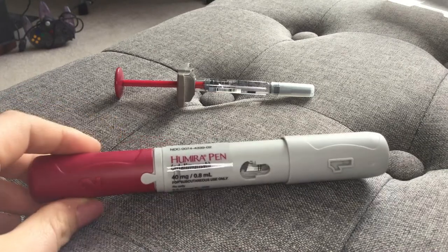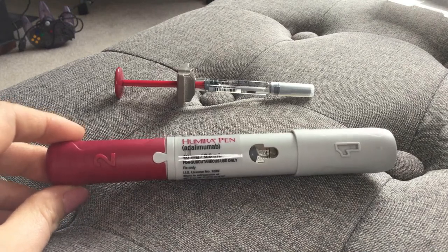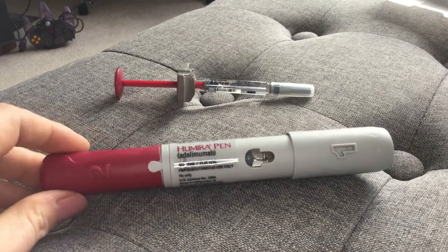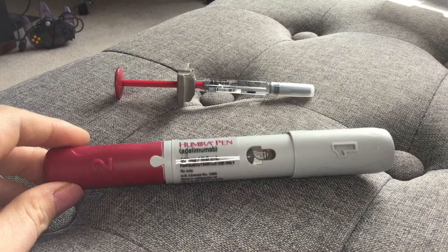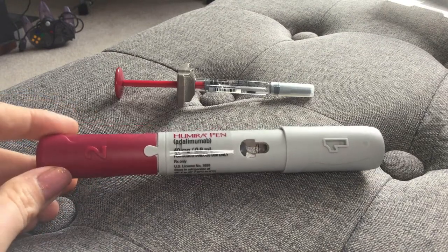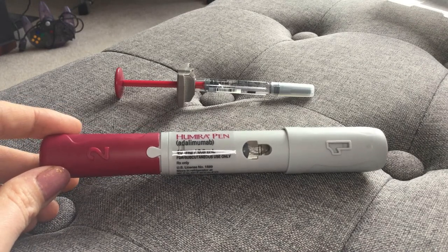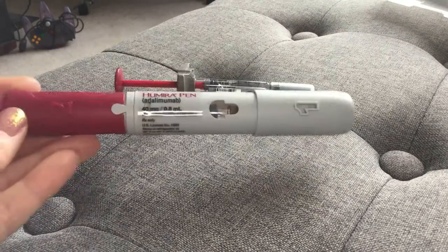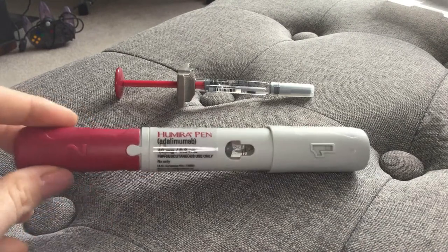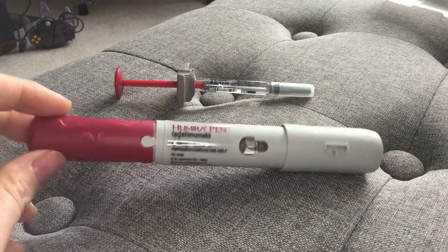Here are some cons about it though. It does make a very loud clicking noise, which can be very alarming. It does hurt — even if you leave it out for a while, it can hurt more than a syringe. I just don't like using an auto-injector pen anymore because I like to be in control. I like to be the one inserting the needle, at my own rate, and I don't like the idea of stabbing myself in the stomach by just hitting a button.